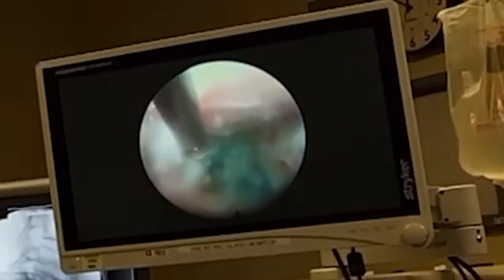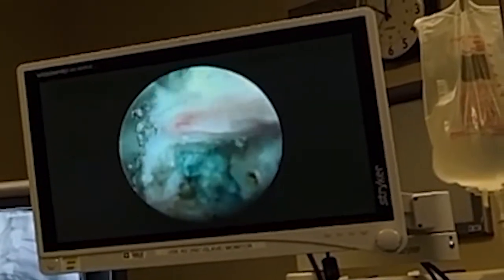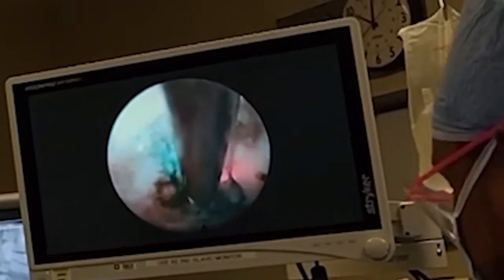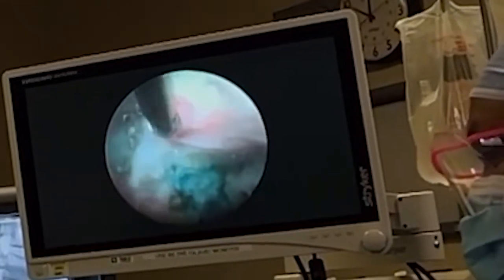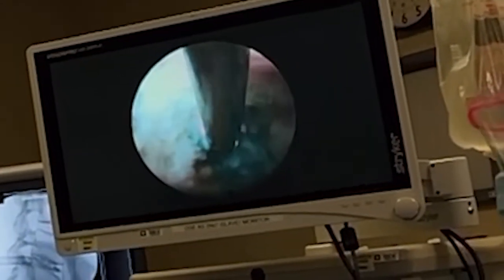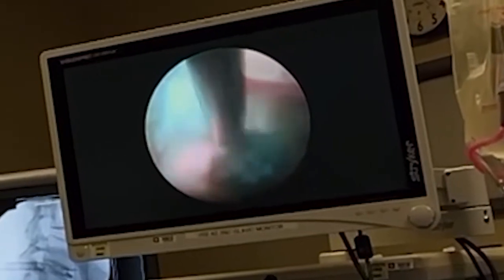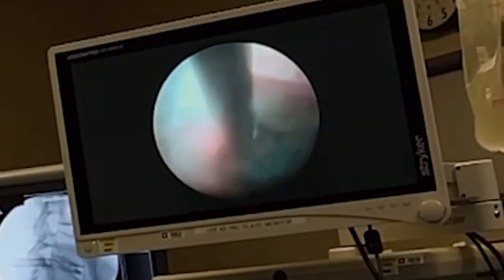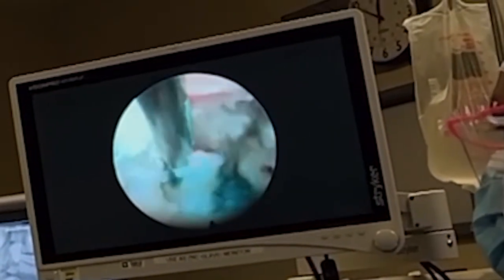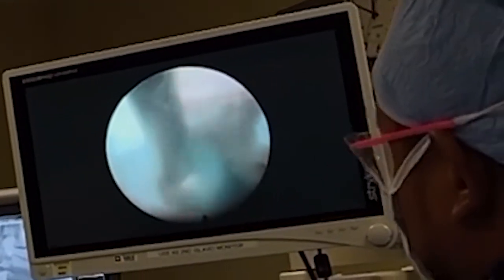So here's the other advantage of the laser. I can work literally right next to the nerve. This is covered by a thin epineurium, but on the other side of that thin membrane is the dural tube. And because it's not electrical and it's so precise, I can work right next to it without shocking or electrocuting it. You can see it shoots off sideways, so it's a 90-degree side-firing YAG holmium laser.